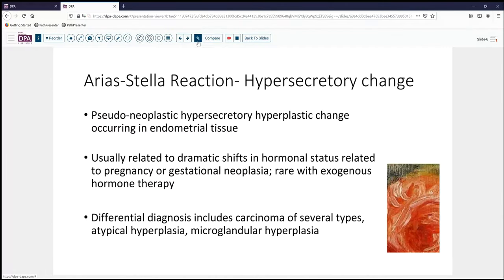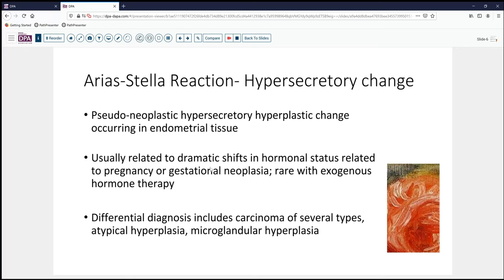The Arias-Stella reaction is a pseudoneoplastic change that occurs in endometrial tissue. It can occur most commonly in the endometrium, but anywhere where you have endometrial tissue — in endometriosis, in the ovary, in endometriotic cysts — other sites could also have this sort of change. It's usually related to very dramatic shifts in hormonal status during pregnancy or with gestational neoplasia. It is very unusual for this to happen with exogenous hormone treatment.